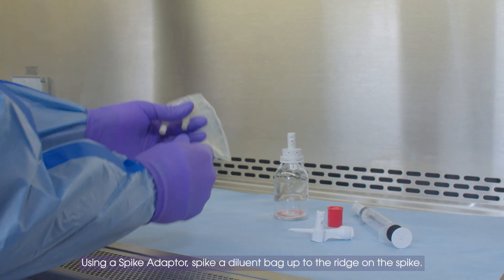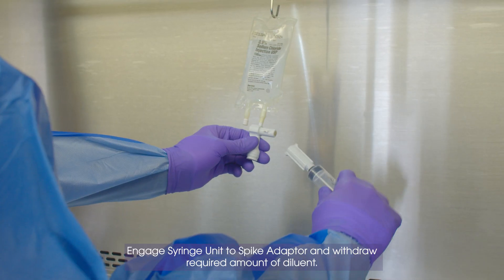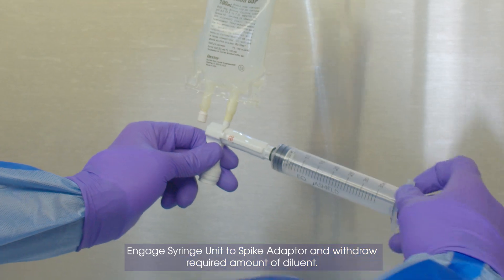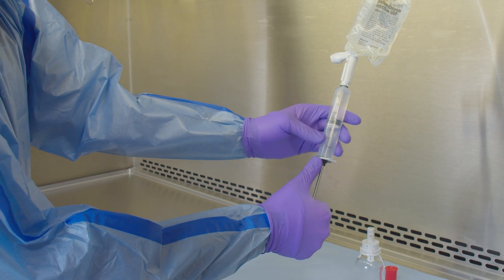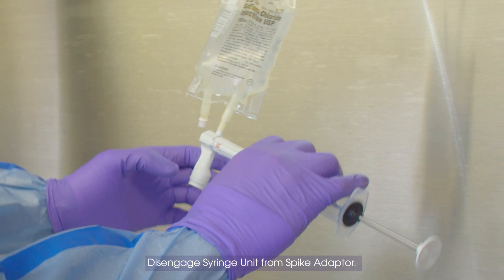Using a spike adapter, spike a diluent bag up to the ridge on the spike. Engage syringe unit to spike adapter and withdraw the required amount of diluent. Disengage syringe unit from spike adapter.